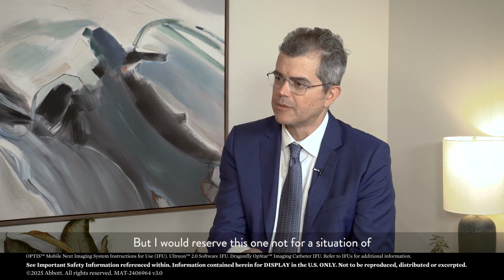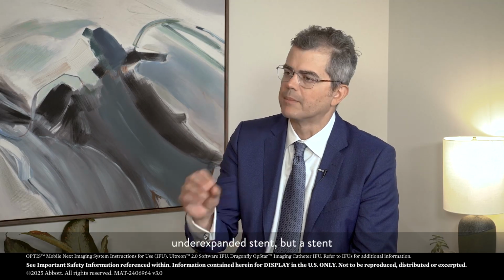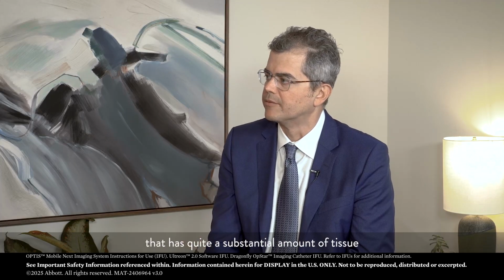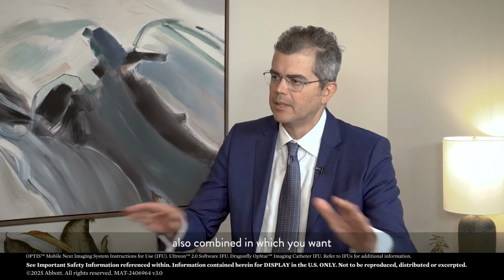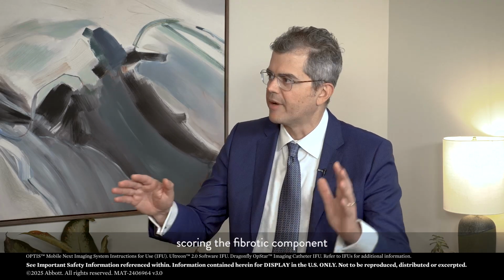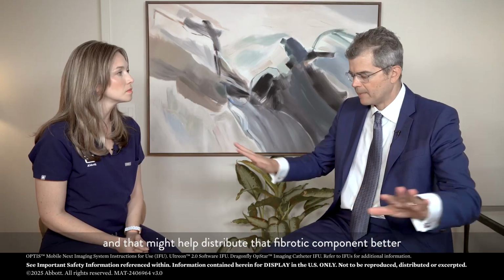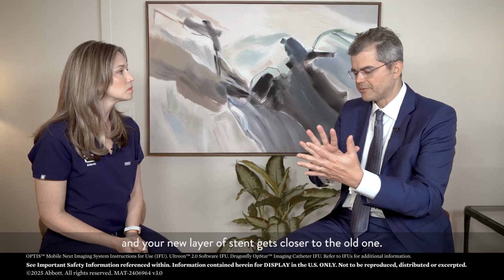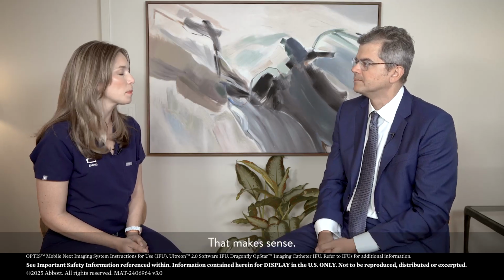But I would reserve this one not for a situation of an under expanded stent, but for a stent that has quite a substantial amount of tissue combined, in which you want to score the fibrotic component, and that might help distribute that fibrotic component better, and your new layer of stent gets closer to the old one. That makes sense.